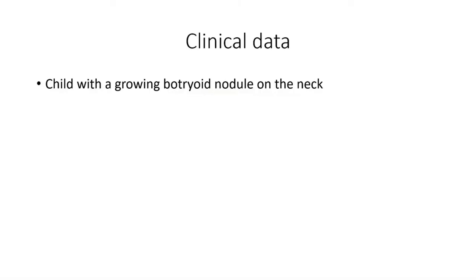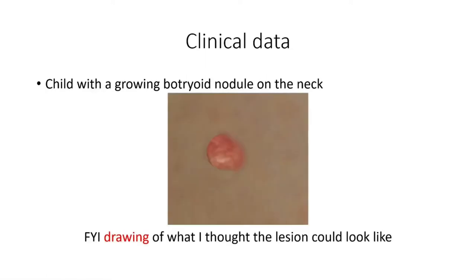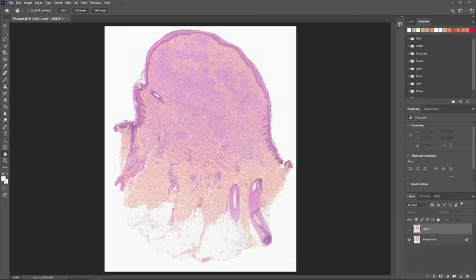The clinical data for this case was a growing nodule on the neck of a child. Here is a drawing I made of what I thought this lesion could look like. On this low-power view, the lesion appears clearly exophytic. It's non-ulcerated. We have large nests in the upper dermis and an expansion that goes into the reticular dermis. There is a fibrotic background and low pigmentation.